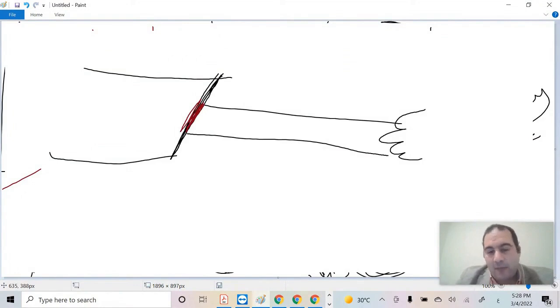What does this mean? It means that the heat capacity, or the anode's ability to withstand heat, is improved. So, has my actual focal spot increased or decreased? It has increased. Therefore, logically, the anode can withstand a higher temperature and has greater thermal capacity, allowing it to handle a higher current.